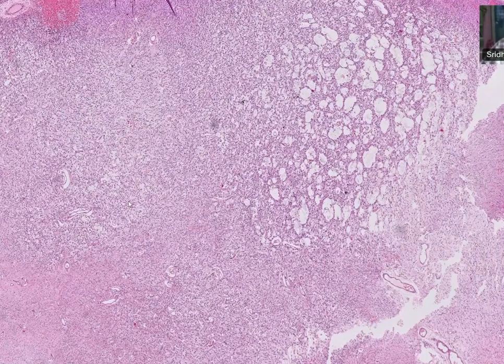So is this normal cellularity or more? It is hypercellular. So you should say at least you can see a cellular lesion with variable areas. Some of the areas are microcystic, others are a relatively compact fibrillary matrix. So this microcystic change is what you can pick up in radiology as T2 hyperintensity.